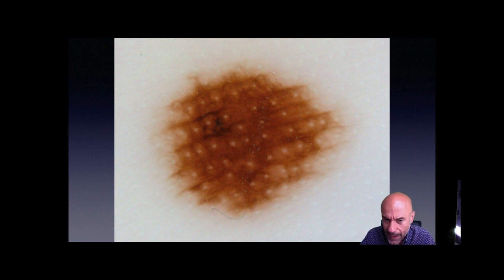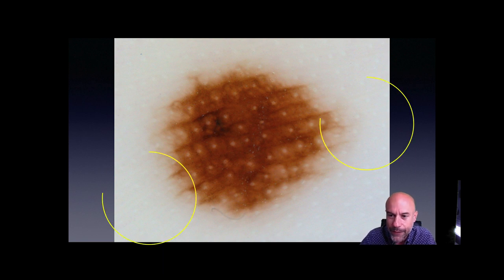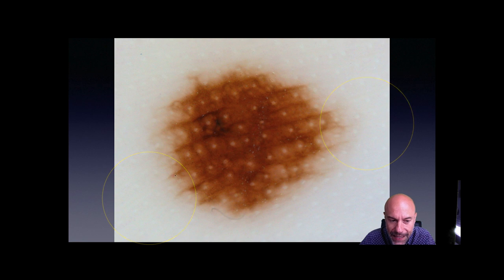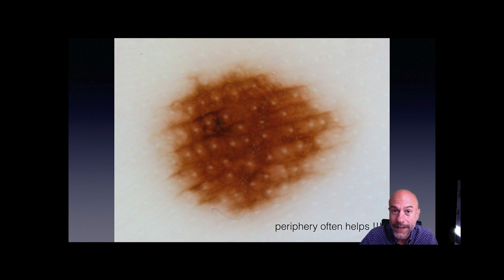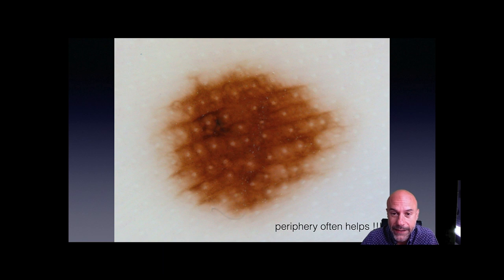In the next example, we can see that in the central part of the lesion there is a lot of pigmentation — practically everything is pigmented, both the furrows and the ridges — so we cannot decide. But if we focus our attention at the periphery of the lesion, we will realize that the pigmentation has the tendency to follow the furrows and not the ridges. The periphery often helps, especially in very intensely pigmented lesions.